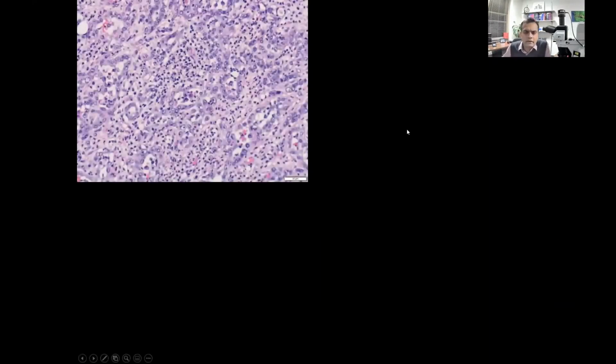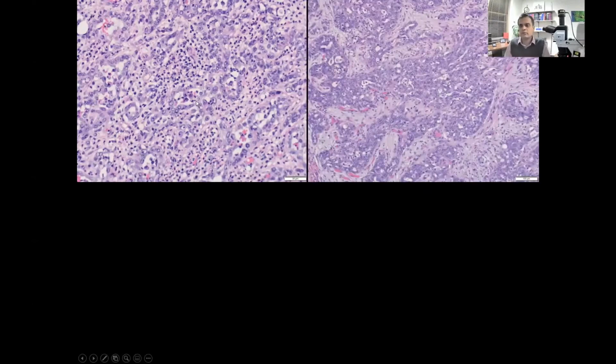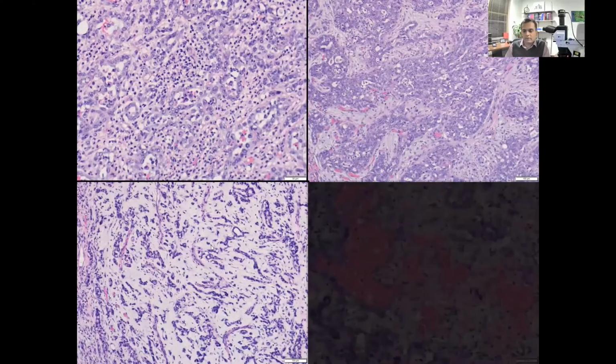Right, so let's go back and look at our morphologic images now. So medullary carcinoma, often we know, has extensive neutrophilic infiltrate, and we did see that. And then medullary carcinoma, as we know, forms poorly formed glandular elements. Sometimes it can have even mucin-like secretion, and typically it has a desmoplastic stroma, which we rarely see in renal carcinoma. So that was there. And this thing, which looked like a mucinous stroma, is again actually desmoplastic change, which is slightly different from the stroma that we see here.